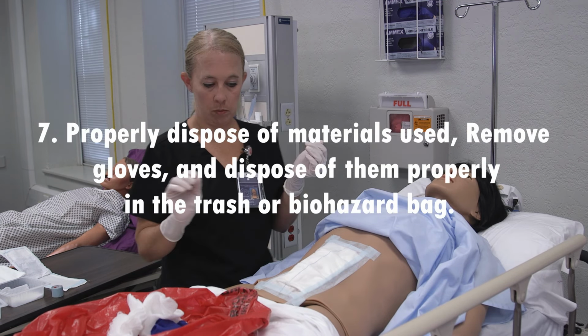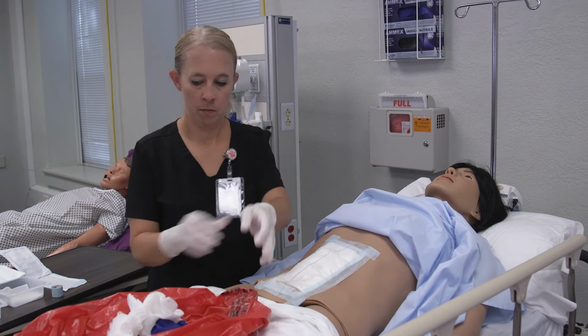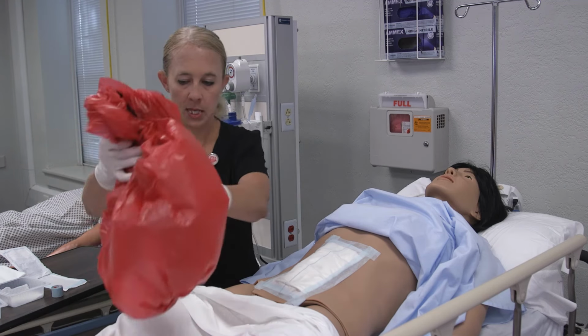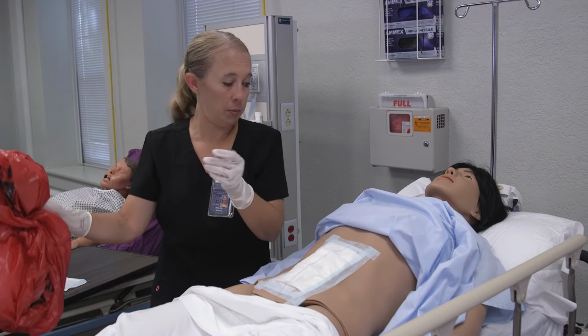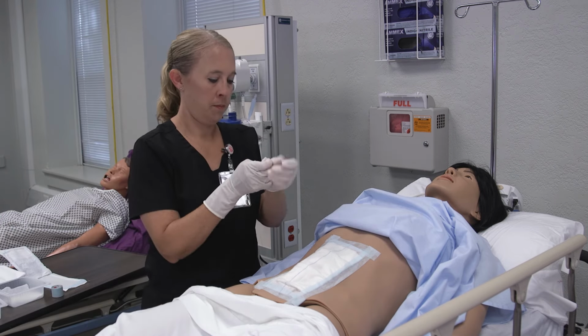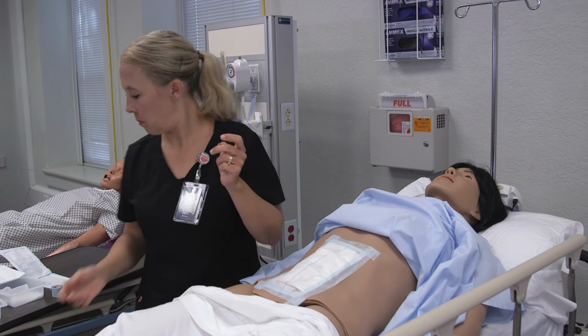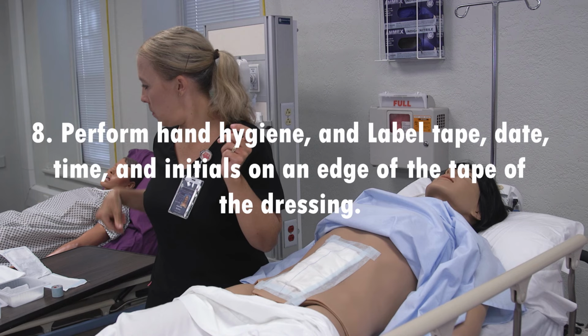Properly dispose of materials used. Remove gloves and dispose of them properly in the trash or biohazard bag. I'm going to get this bag off of the bed for you and I'm going to put it in our biohazard trash can. Perform hand hygiene. Label, date, time, and initials on an edge of the tape of the dressing.